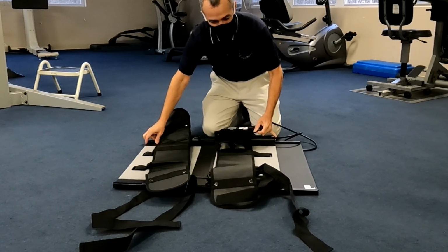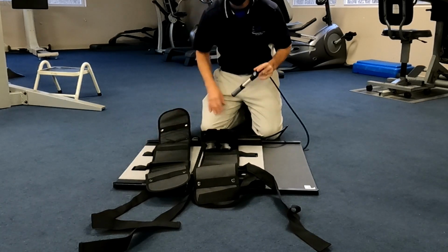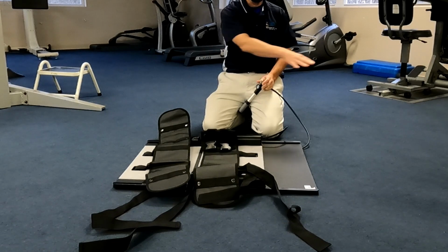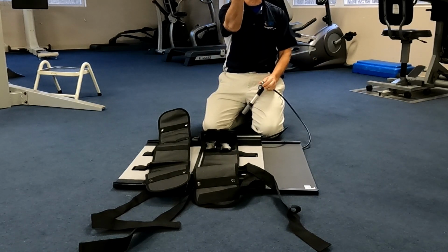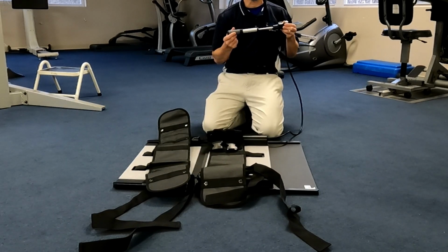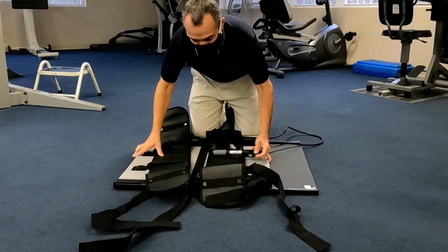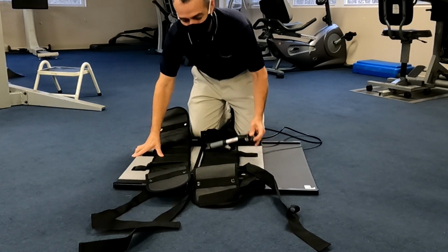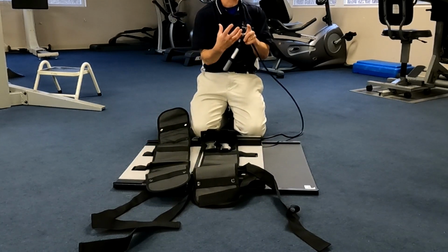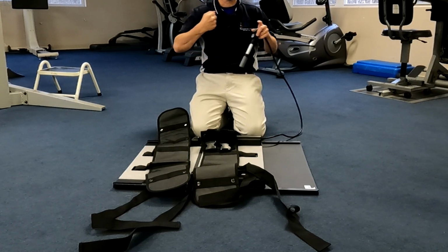Okay. I'm gonna bring it in kind of close together. Right there. The head is gonna be there, your feet are gonna be down here, your face up. Okay. As we pump the device, the bottom will start to move away from the top. And so the whole idea, the goal of this isn't to try and overpower the musculature. If there's pain, if there's a spasm, we're not trying to just rip it apart.